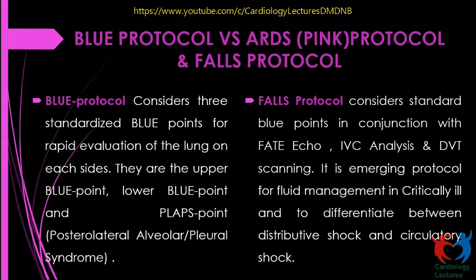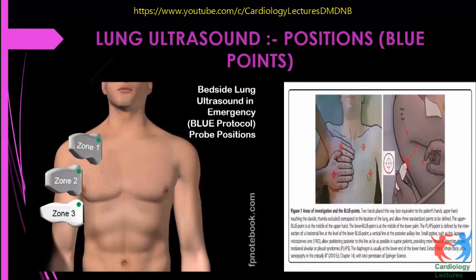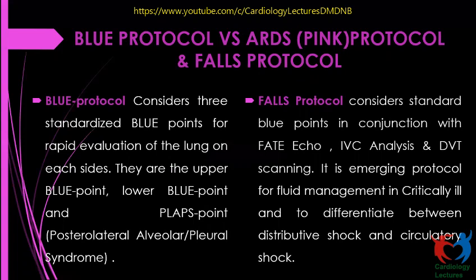It has an addition of transthoracic echo, that means focus assessed transthoracic echo in emergency. Also sometimes IVC analysis and DVT scanning. It is an emerging protocol for fluid management in the critically ill, and to differentiate between the different types of shock, distributive shock and circulatory shocks. So we will stick to these 2 protocols.